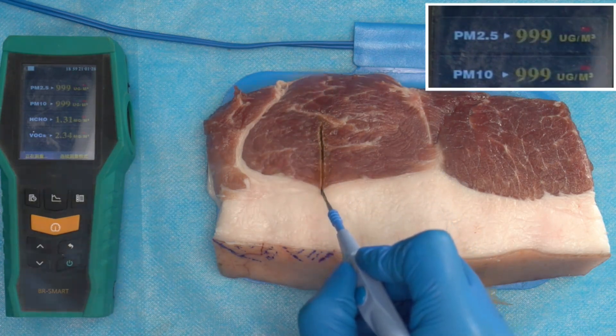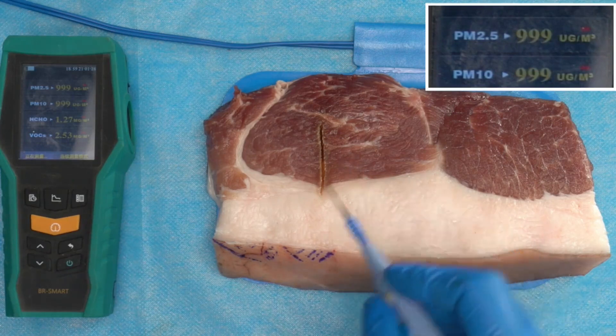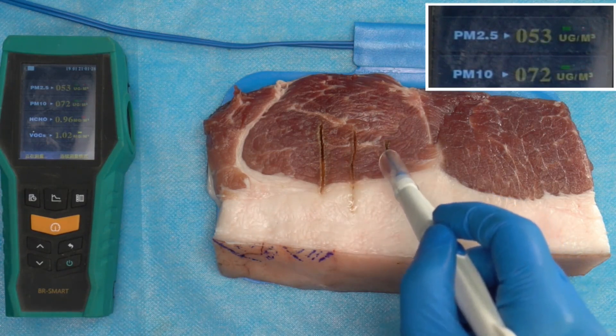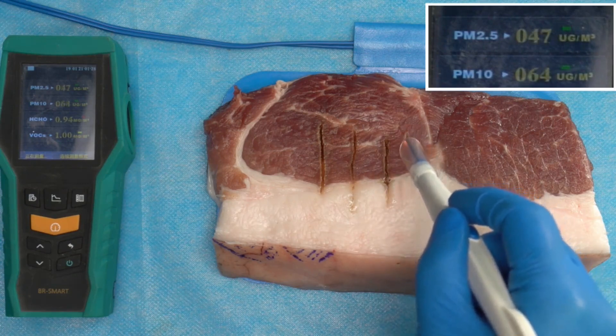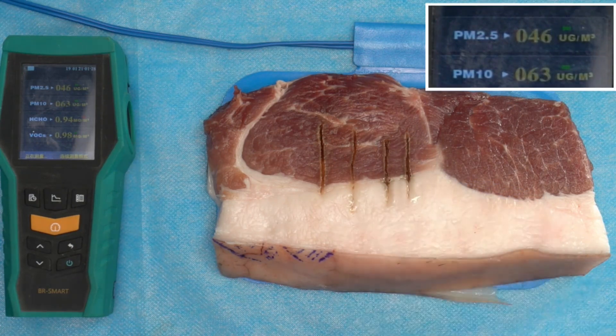When the TactFall S300D and the TactFall smoking device Smoke 3000 Plus are used at the same time, the smoking function can be easily realized. When the Smoke 3000 Plus is not connected, a large amount of smoke is easily generated during the operation — the PM2.5 test data of the instrument exceeds 999 at this point. When the Smoke 3000 Plus is connected, the smoke generated during the operation can be automatically and safely discharged, and the measured PM2.5 value drops to less than 100, perfectly realizing smoke-free operation.